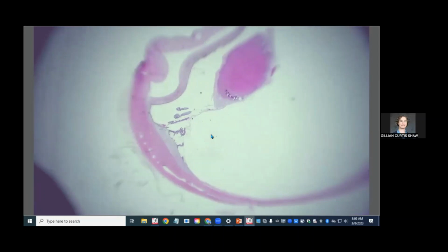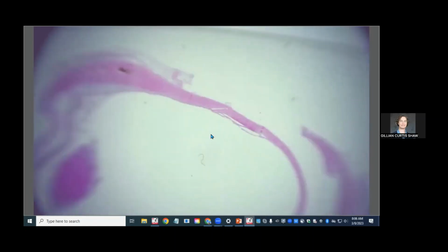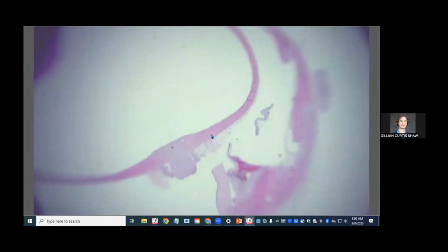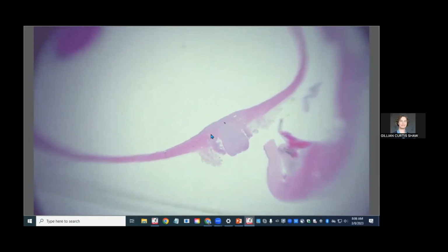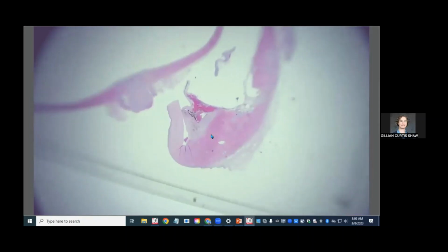There's the ciliary body at that side, ciliary body at this side. And then as we go around, the retina is difficult. Well, actually, it's not sampled. So the retina in the gross photo is floating up here in the vitreal space. But here's the optic nerve head. And then we threw in an extra slice, which has all the good stuff happening.